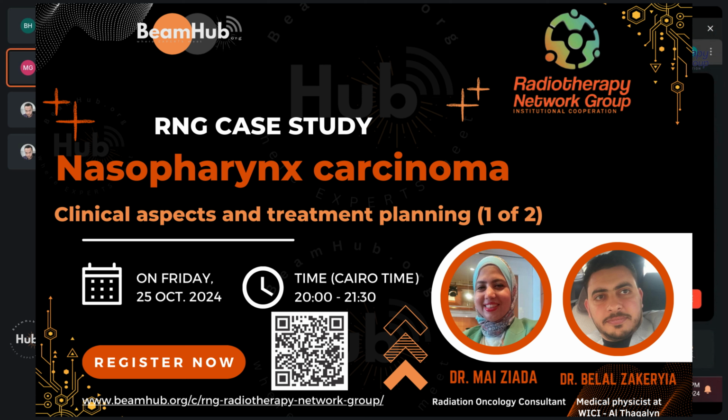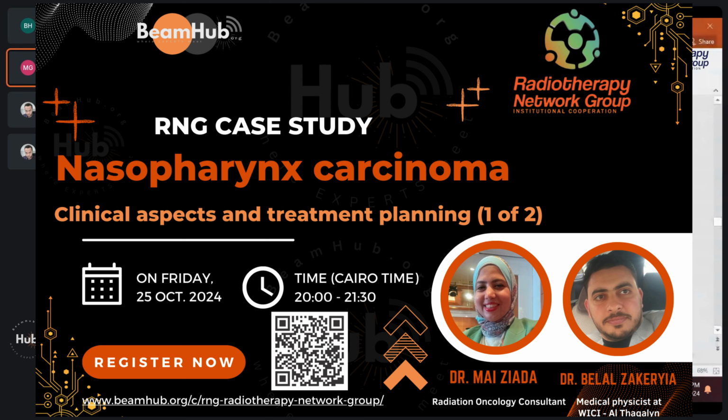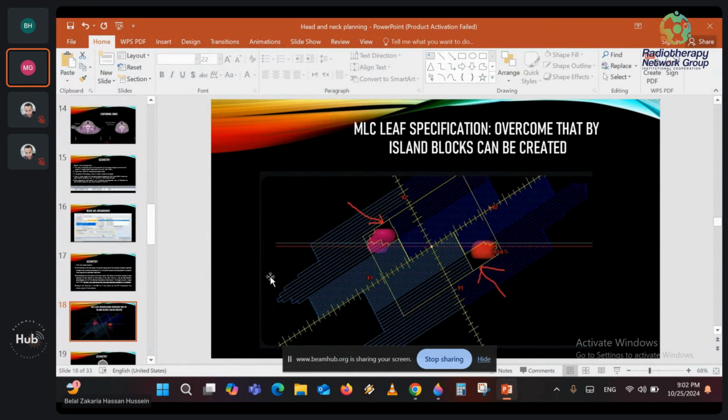Any other questions? I have a small question for you, Dr. Bilal. You can make a very good plan on the planning system, so what are you doing in your center to verify the deliverability of this plan?